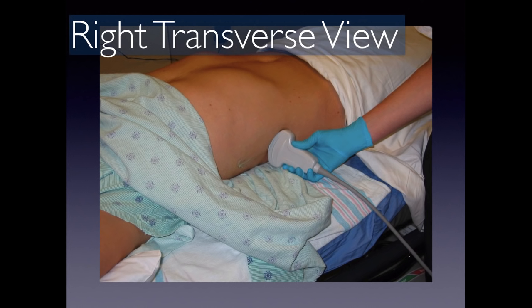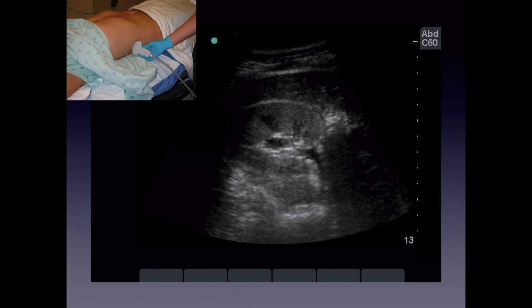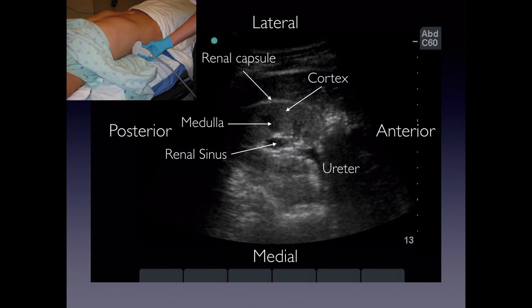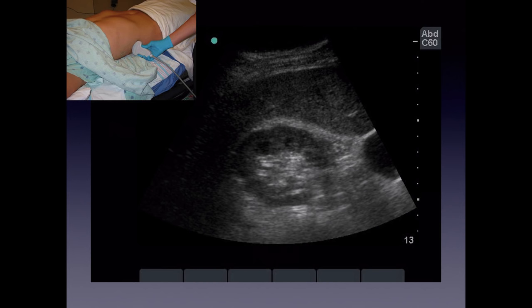For the right transverse view, we remain on the same side with the indicator towards the bed to get a transverse image of the kidney. In this orientation you can actually see the ureter coming out of the kidney and a medullary pyramid. The lateral-to-medial orientation hasn't changed — we've just flipped the transducer so the indicator is now posterior, with the opposite being anterior. You can also see the renal capsule and perinephric fat.